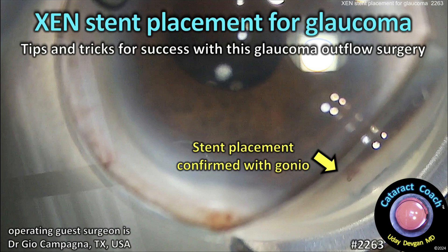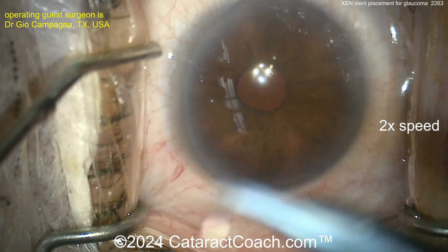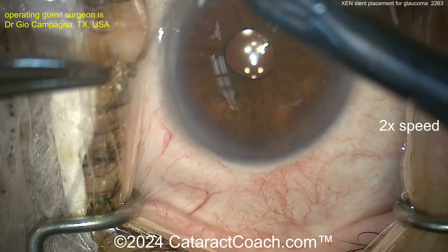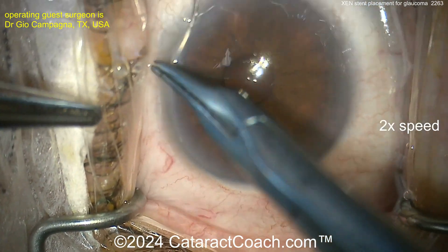Cataractcoach.com — XEN stent placement for glaucoma: tips and tricks for success with this glaucoma outflow surgery. This patient is already pseudophakic but needs another procedure to help lower intraocular pressure due to glaucoma issues, so a traction suture is being placed.